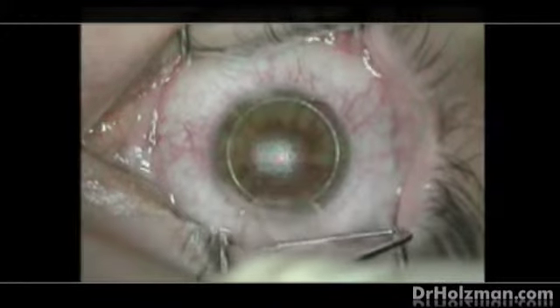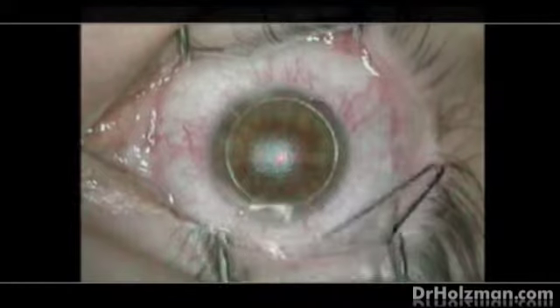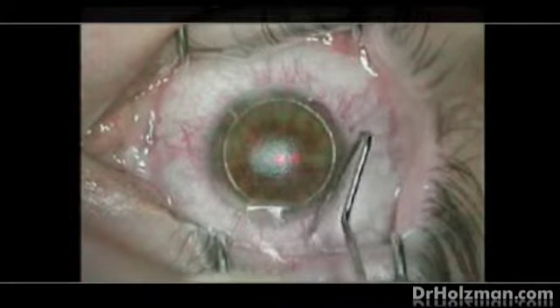It takes about 25 seconds to do that, during which time the vision darkens for the patient and there's a mild pressure sensation. The patients that are calm and are going with the flow and are feeling comfortable, which is most everybody, feel either no pressure whatsoever or mild pressure. So we really want to keep the anxiety level low, and like I said, everything's designed to keep the patient's anxiety level very low.